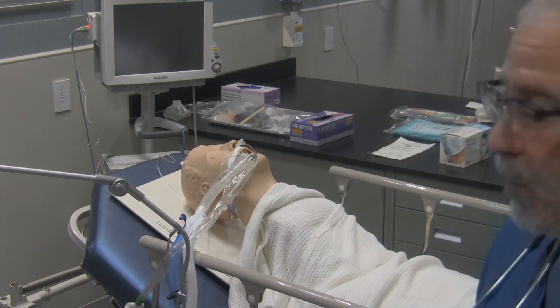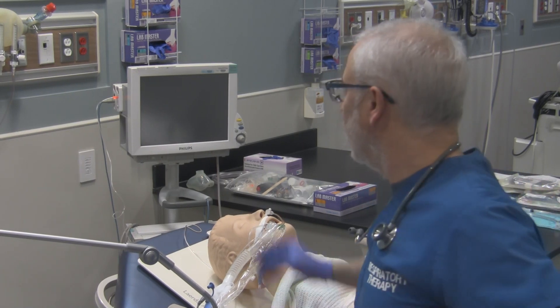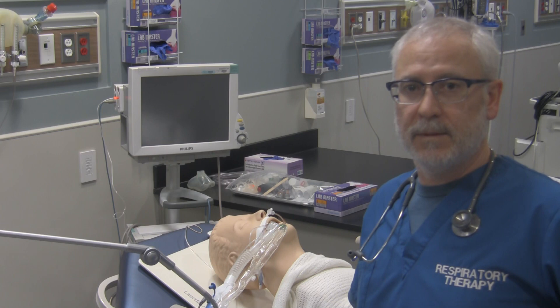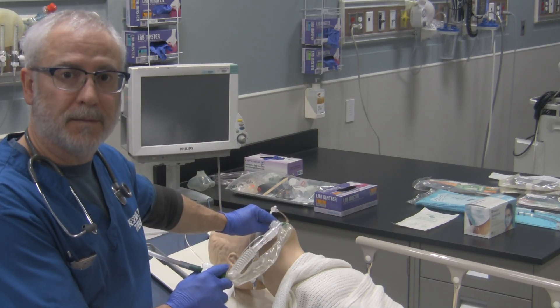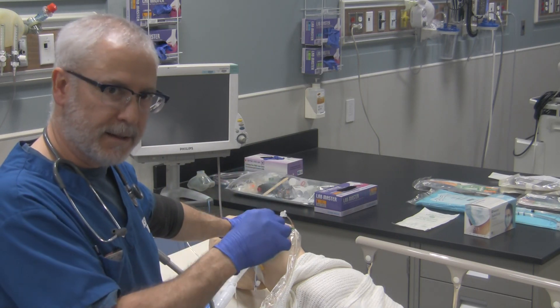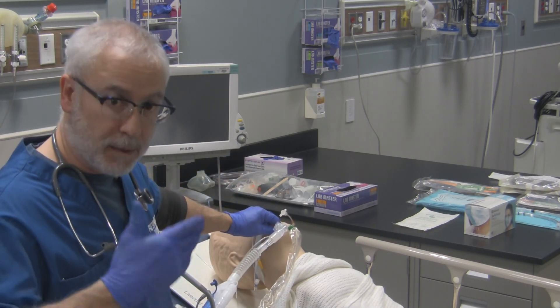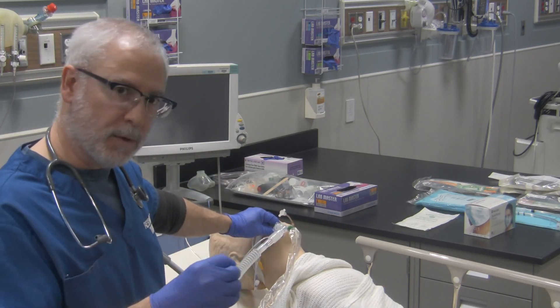To recap the setup: the patient is hooked up to the closed suction system, suction is set to minus 120 mmHg, we've assessed vital signs, listened to the chest and confirmed the need for suctioning, and the ventilator oxygen is set to 100%. Now we're ready to suction. When suctioning, stabilize the endotracheal tube — advancing the suction catheter puts strain on the ETT, and if the securing device is loose you could accidentally advance the tube further into the trachea, potentially causing a right main stem intubation. On withdrawal, you also don't want to accidentally extubate the patient.